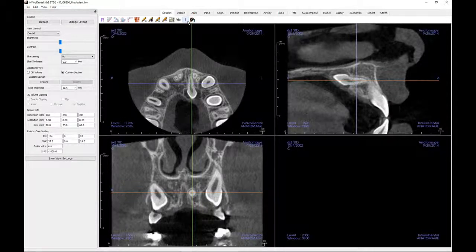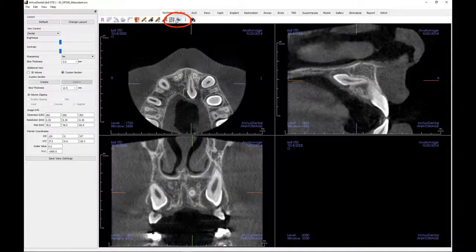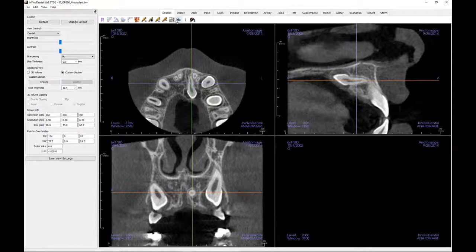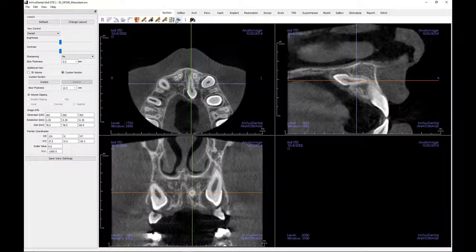The cursor lines may be put behind the images or rendered invisible. Click the toggle cursor visibility icon once to put the cursors behind the images, and click again to render them invisible. Click again to have them reappear.